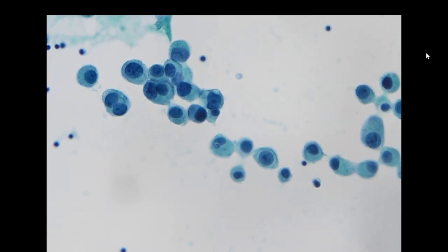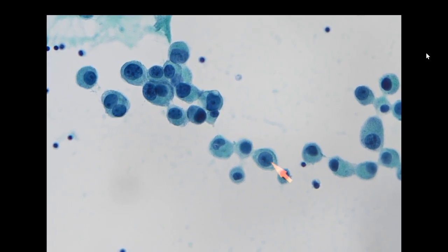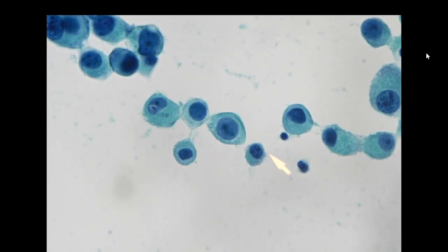diagnostic clue for me, I would usually search first for a very prominent nucleolus, which is more common in metastatic adenocarcinoma. The second, I would try to look for cytoplasmic vacuoles, which are also more common in metastatic adenocarcinoma. But if you ask me, what is this cell? Is this a reactive mesothelial cell, or is this a poorly differentiated adenocarcinoma?